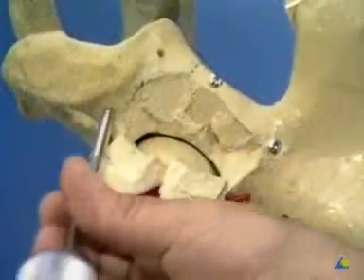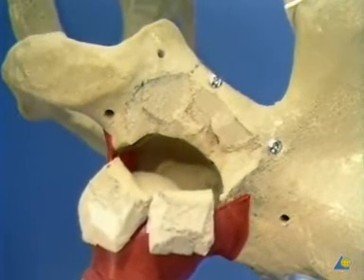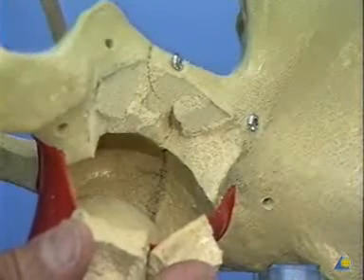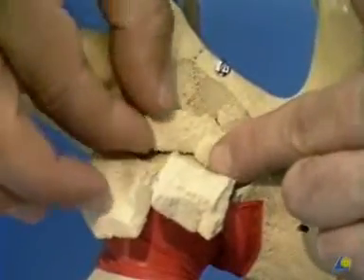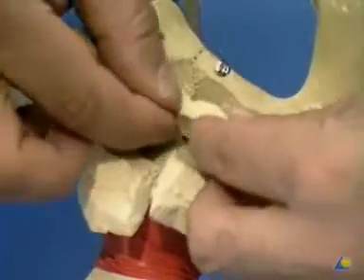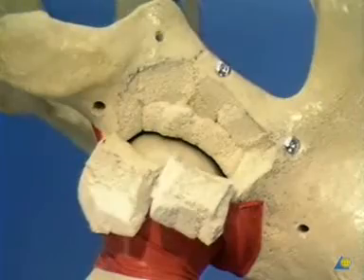After removal of the pelvic reduction forceps and the shank screw, the articular reduction can be checked by distraction of the femoral head with the traction table. The femoral head is reduced again into the joint with the release of traction, and the posterior wall is reconstructed, beginning with the free fragment of cancellous bone and cartilage. This fragment will be held in place by the overlying posterior wall fragments.